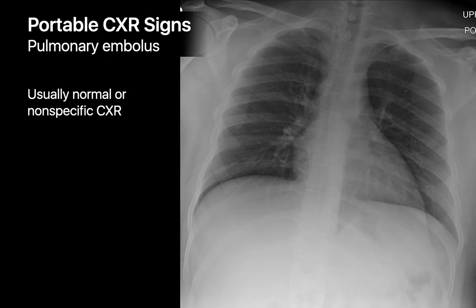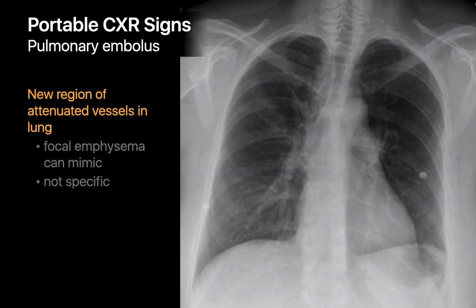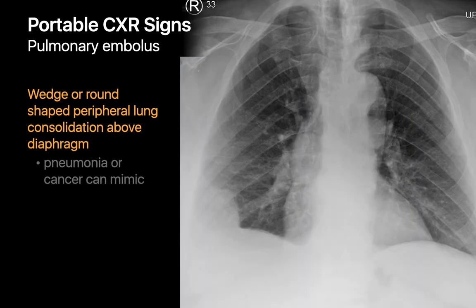When a patient has a PE, most of the time their chest x-ray will appear unchanged from prior or normal. Perhaps you will see a very small pleural effusion, which is also a very non-specific finding. Occasionally, if a PE is large enough, you might notice a lung region where pulmonary vessels appear newly attenuated compared to a prior chest x-ray, but this is a subtle and non-specific finding most often caused by overpenetration due to technique or focal emphysema. If the PE has caused a large enough pulmonary infarct, you might see a new focal peripheral lung opacity, though this too is non-specific and much more often caused by focal lung infection, pneumonia, or cancer.